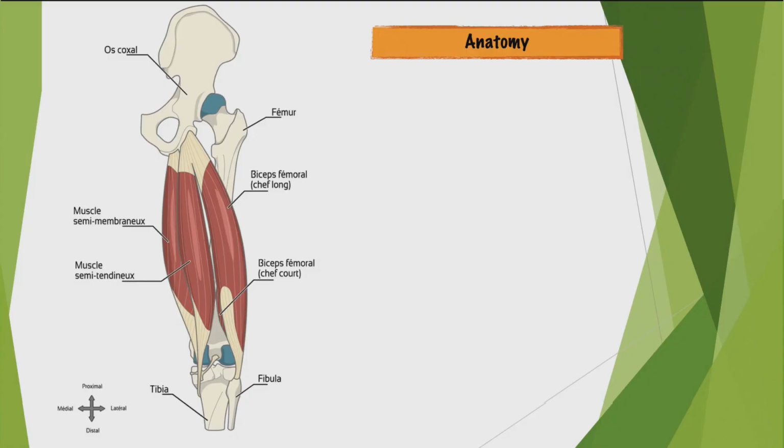If you know what you're looking for, if you know what the basic structure looks like, because you've studied anatomy, but you've also looked at the contralateral side, you're going to be much better at studying musculoskeletal. Here, in this patient, the most lateral part of our tendon appeared overall fibrillar all the way to the ischium, while the most medial part of our tendon was totally anechogenic with an impression of fibrillar rupture.